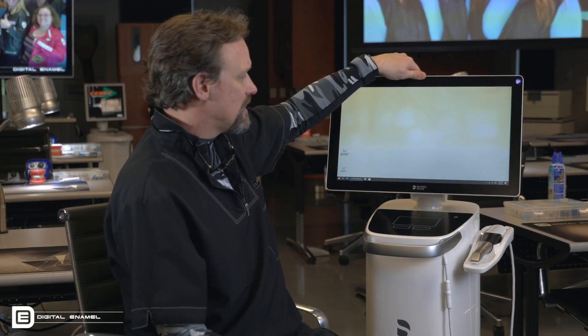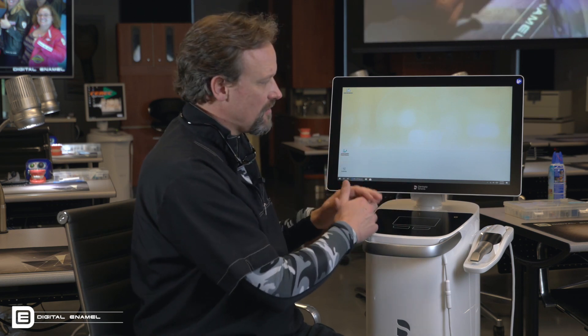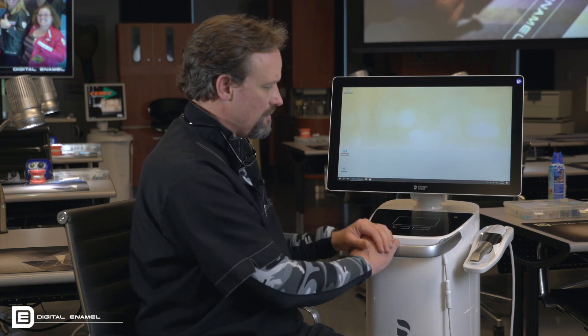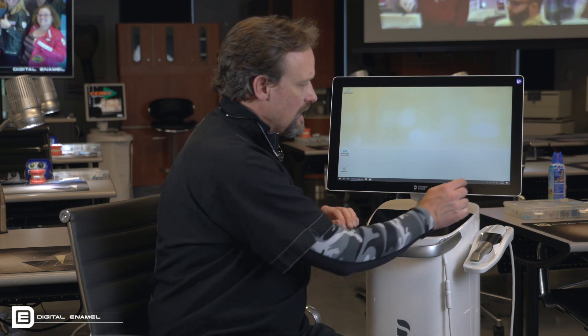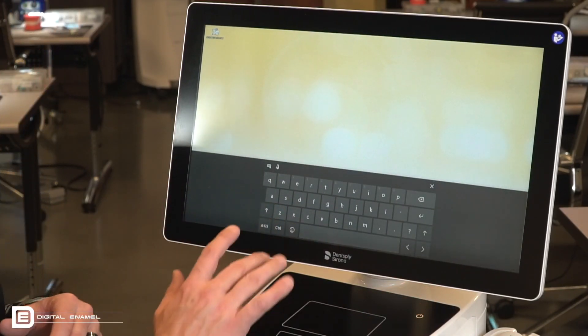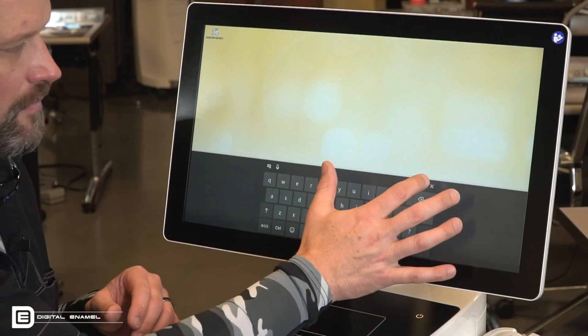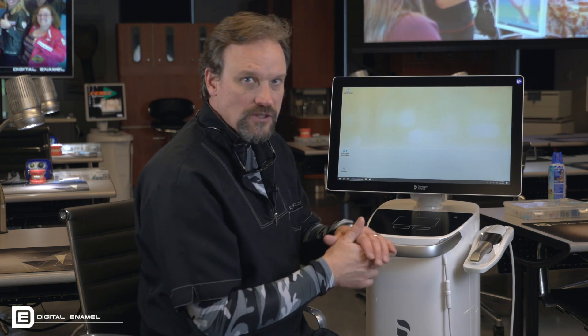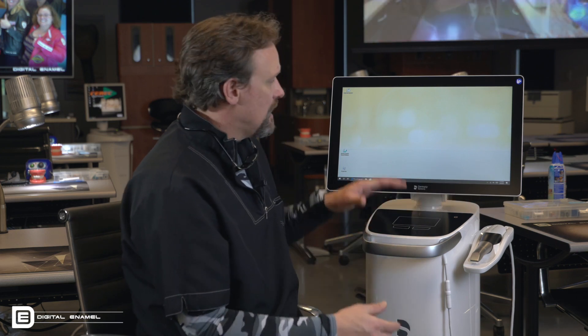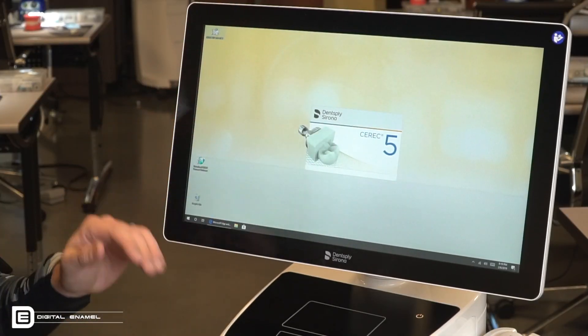If you're not familiar with Windows in this configuration because there's no keyboard, there's an icon right down here — you just click on it and the keyboard comes up so you can type as you need. Just like in prior CEREC versions, there's an icon you can double-click on it, or you can double-click on the trackpad to open it up.